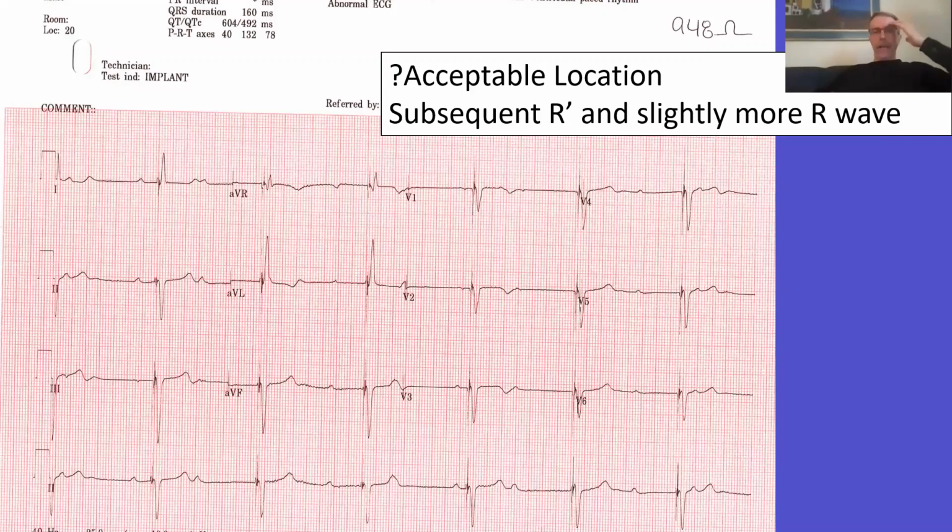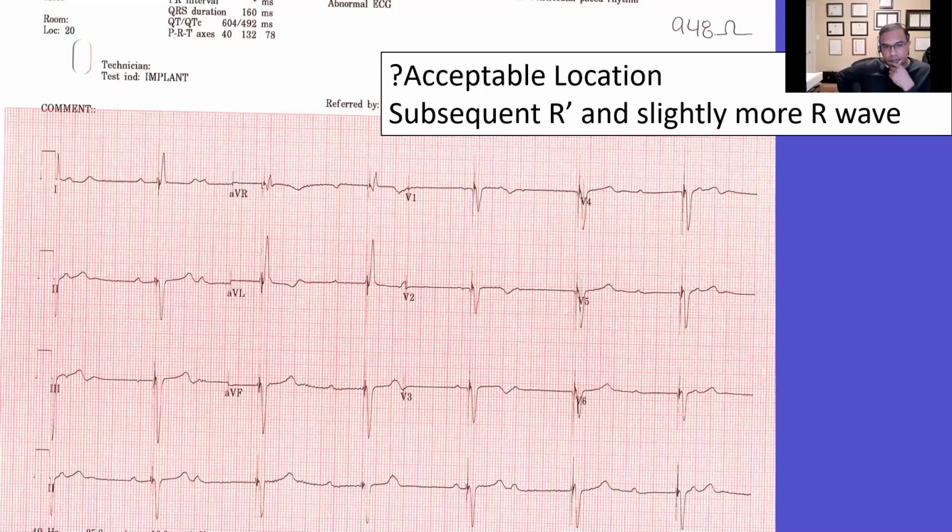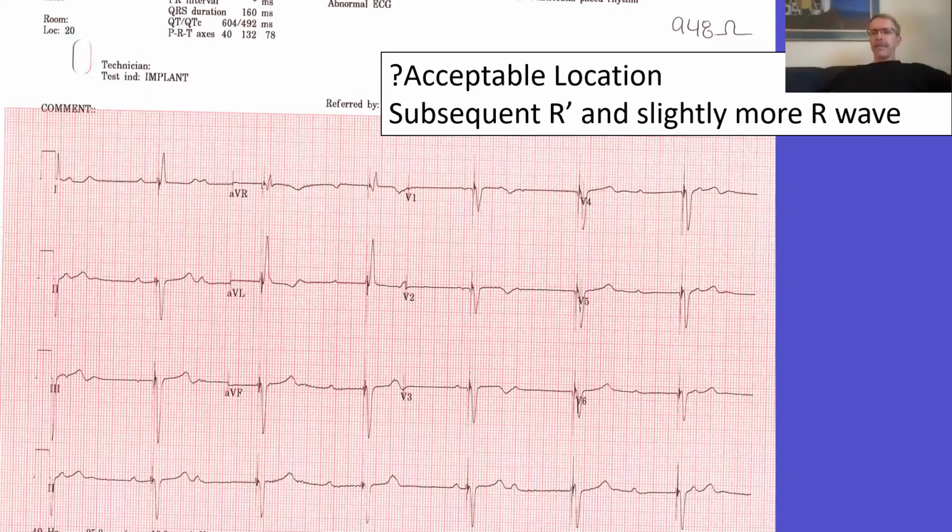And to do the stim to LVAT, are you taking it to the trough of the S in V6? I mean, what do you call an LVAT in that? Yeah, I would go to the trough in V5. It's hard because usually V5 should be positive, and that's typically how the LVAT is measured. But it's still an indicator of left ventricular activation time, right? Okay, I'm glad. I do believe a lot in the QRS area. So this is almost a normal QRS.